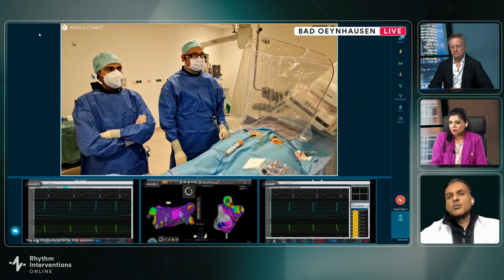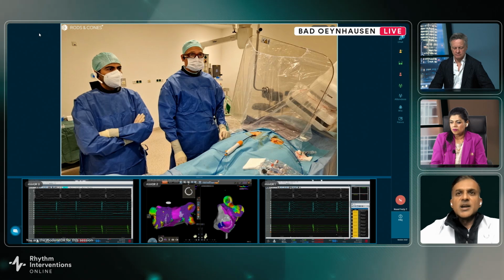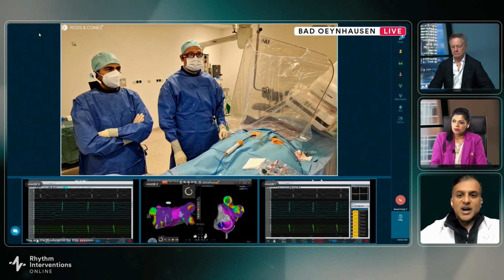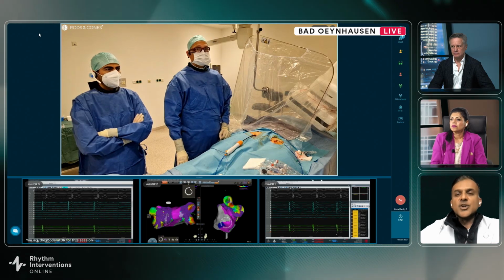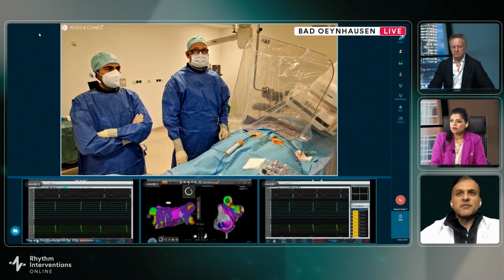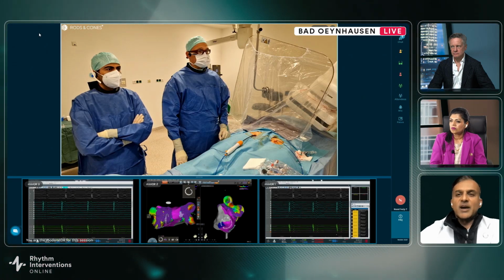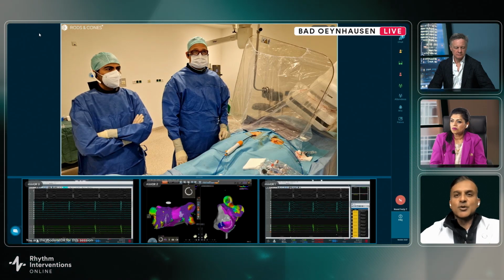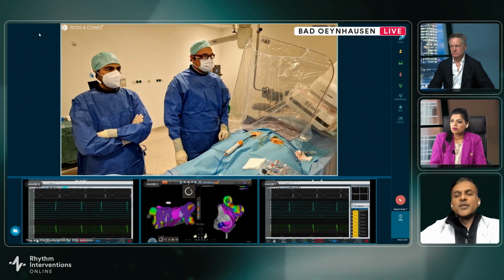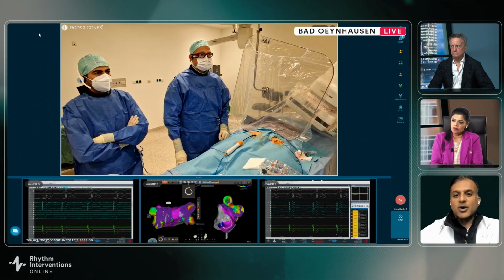But for us, when we have the veins isolated, we tend to do the posterior wall, and we're now actually doing a fair amount, again off-label, of superior vena cava isolation. We'll map the sinus node with high-density mapping, and the catheter is very efficient and well-suited for SVC isolation, without what we have to worry about with RF, sometimes not being able to ablate circumferentially because we're close to the phrenic nerve. So that would be our approach for someone where we have PVs that are isolated but still have recurrent AFib.